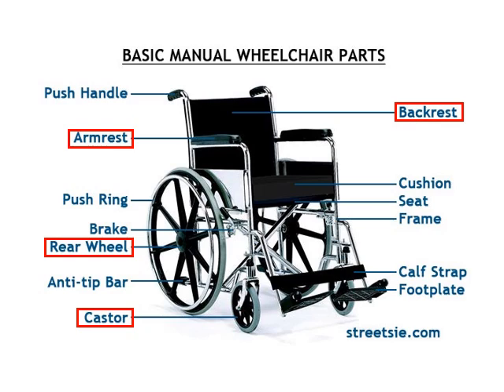There are foot plates and leg rests. Sometimes they're fixed and sometimes they can be folded out of the way. We want them to fold out of the way, especially when we're doing transfers.